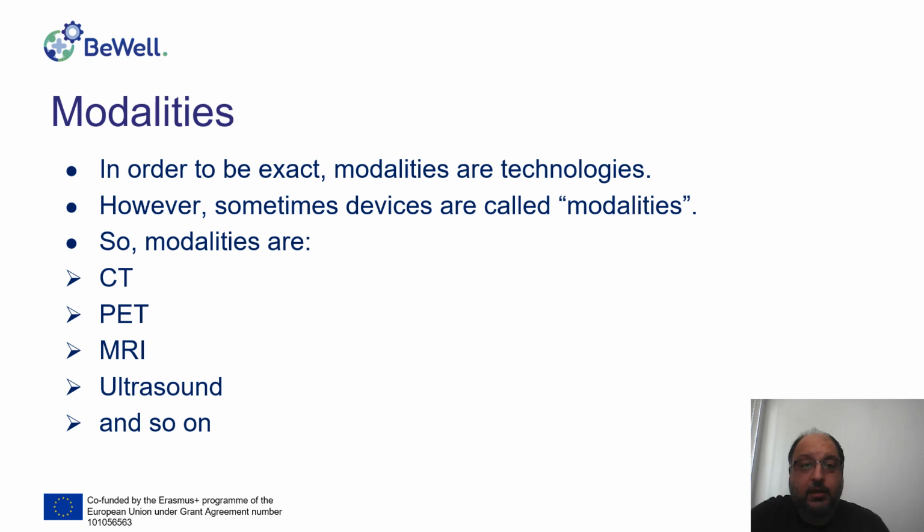So when speaking about modality, this is computed tomography, not the computed tomography scanner. The computed tomography scanner is the device, and computed tomography is the modality. The same is with positron emission tomography, magnetic resonance imaging, ultrasound, and so on.